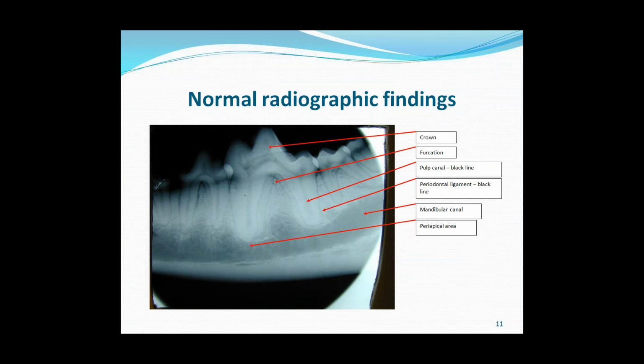What we'll do is we'll have a look at some of the normal radiographs, some of the normal findings that we'd see on a radiograph, and then we'll have a look at some of the pathologies that you'd also expect to see as well.